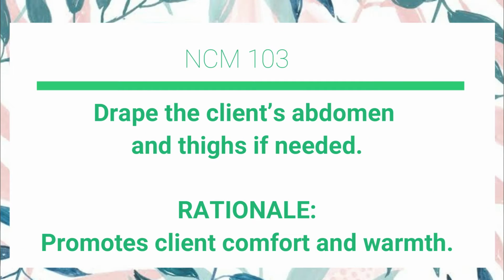Drape the client's abdomen and thighs if needed. It promotes client comfort and warmth.